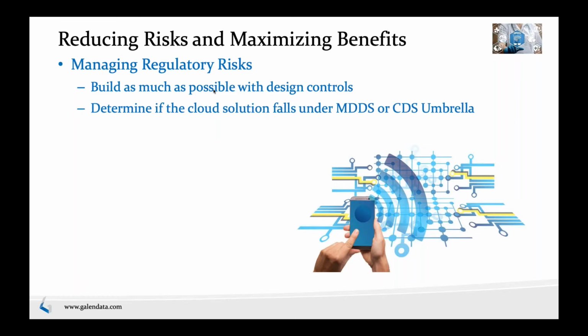Determine if your cloud solution can fall under either the MDDS or the CDS umbrella. And this is again for FDA. There are similar aspects if you want to do CE marks and the European MDRs around that. But there are benefits of doing that. One is you don't need the same kind of approval process if your cloud can fall under MDDS, even if your device is not. If your device could be a class 2, requiring a standard 510(k), you may be able to put your cloud under an MDDS umbrella.